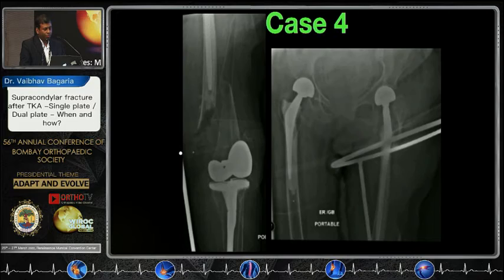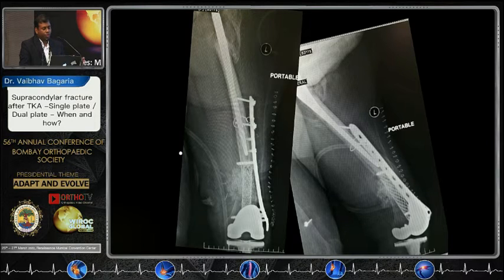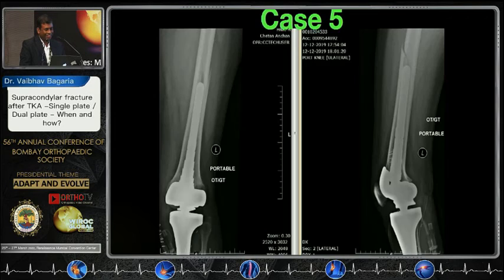And sometimes life gives you a googly, like this case. We'll have case discussion. Again, something where you don't have enough space to use a plate. So the principle is that you use dual things. This case I did with Dr. Tanna, with an arthroplasty surgeon. So we said we'll take the person who will be able to do it, and that's the result.